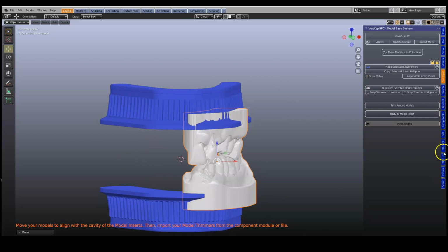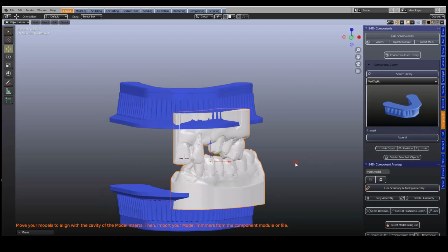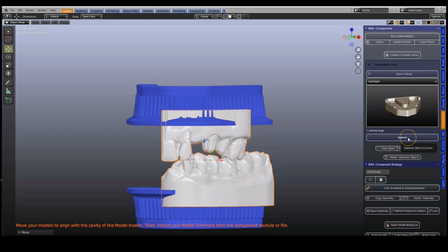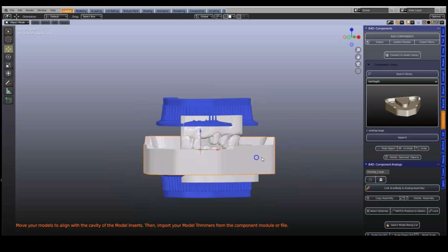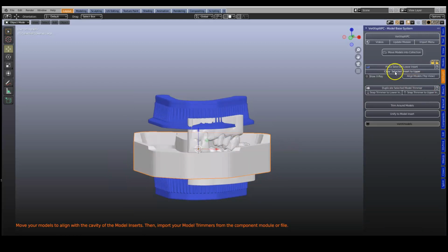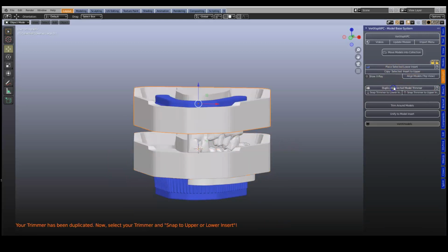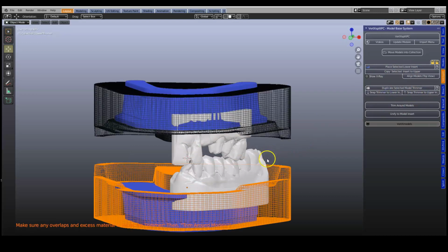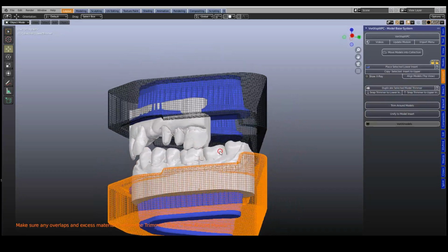We're going to go to the components module and we're going to choose our cutters. Now we know that one's quite big. I'm going to use a big cutter. Okay, append. I'll take this one. In the VertXsplit, I'm going to copy, so duplicate. Then we're going to take that and snap that to the upper. Take that and snap that one to the lower. Okay, so that's looking good.